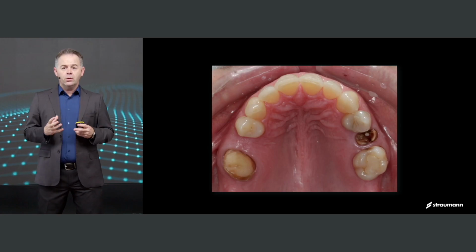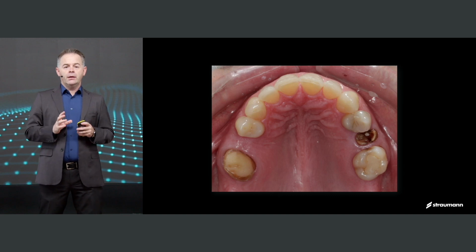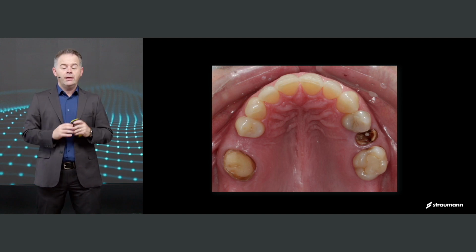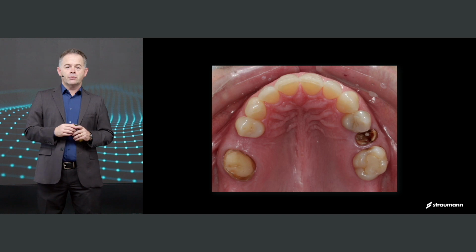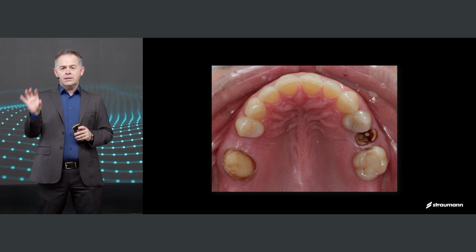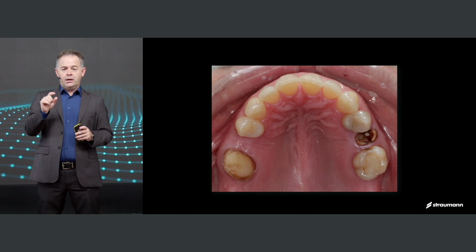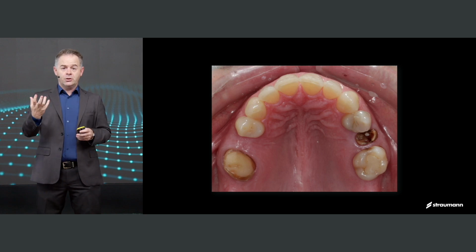We bring to a closer look, see how she has this shy smile because she knows it's already missing a premolar on the left side and a premolar on the right side. When we look at the occlusal view, you see clearly the number 15, it feels like a healed site, it resembles a healed site, but hold on, I have a surprise for you there. And on the other side, you have tooth number 25. That is already a hopeless residual root. It needs to be extracted.